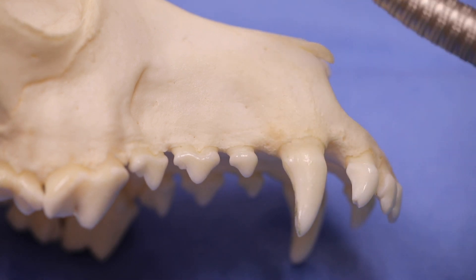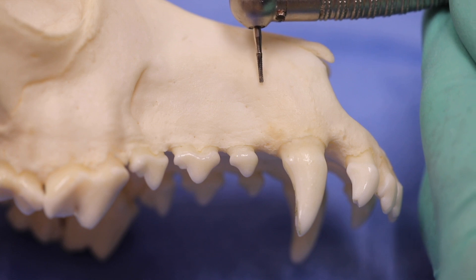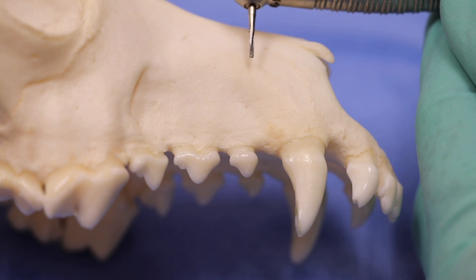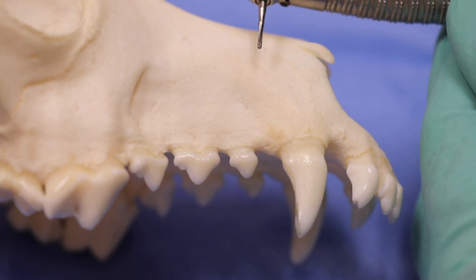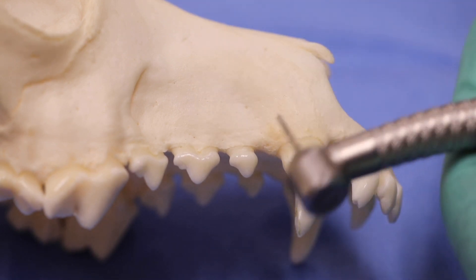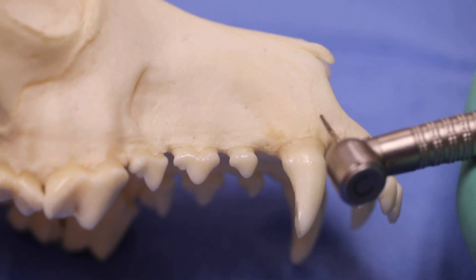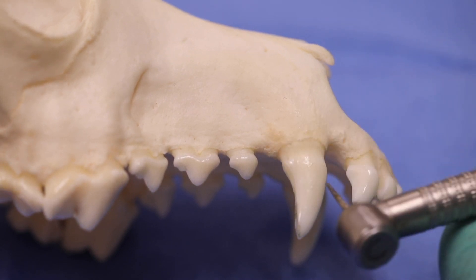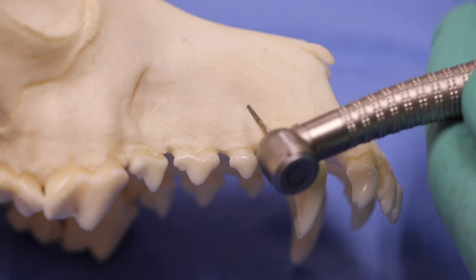What happens is when we make our grooves, we're actually going into the tooth. That is extremely detrimental to your time involved and also makes it almost impossible to use your elevating luxators to get that tooth root out of there. So we want to make sure that we start coronal and visualize the bone-tooth interface on both the mesial and distal aspect before we even think about removing bone as we move apically.